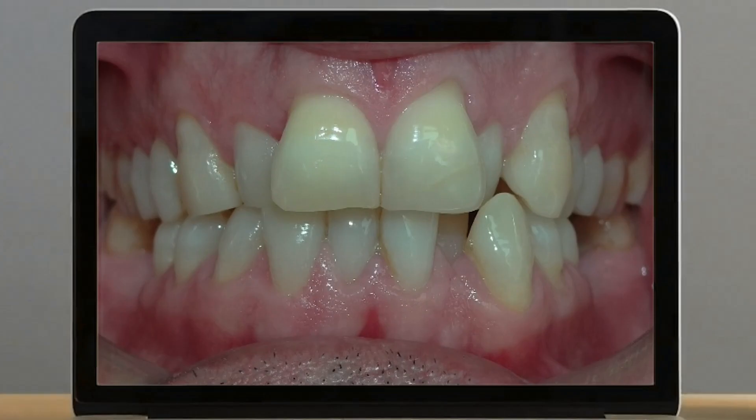Clinical case. This is an adult patient with overcrowding, with obvious periodontal problems, with incorrect teeth shape, and with slight recessions. If we align without previously performing stripping, what happens is that black triangles will appear here, and there will be recessions here.